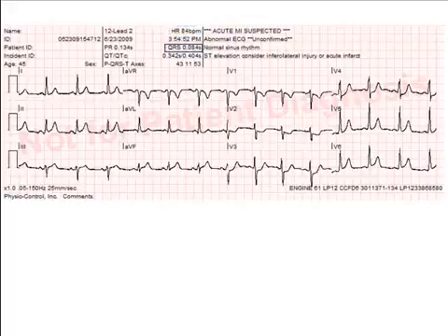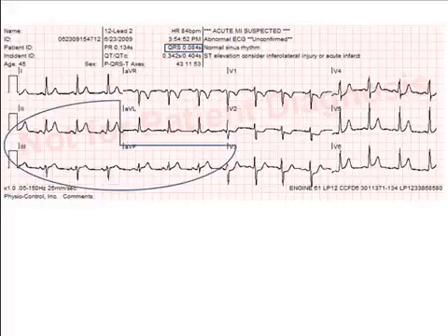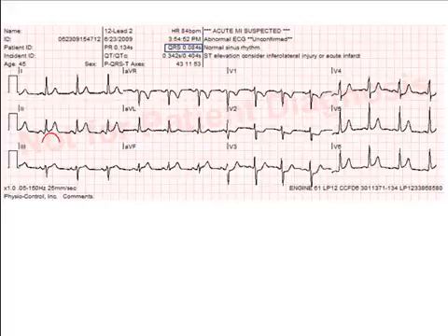If it's abnormal, then any ST elevation would most likely be a mimicker. The QRS duration is normal, so we look at the inferior leads for ST elevation. Do you see any? Yes, in leads 2, 3, and AVF. So we delay nitrates and perform a V3R and a V4R to rule out a right ventricular infarct. Only one of these right-sided leads has to show ST elevation to suspect this RVI. Now we can perform nitrates if no suspicion of an RVI is present.